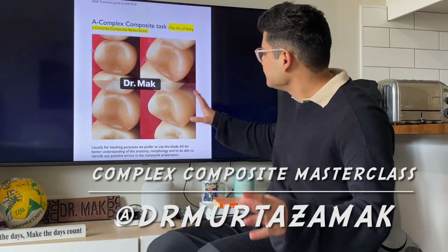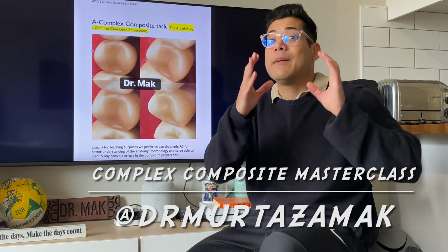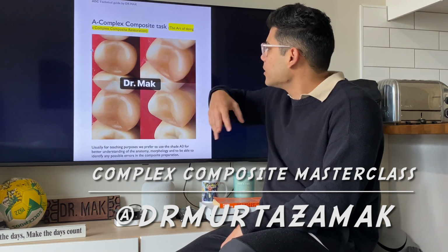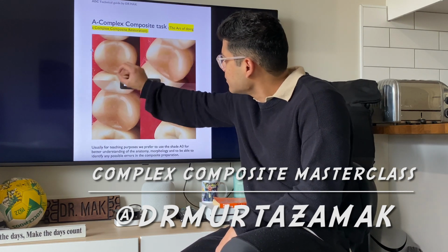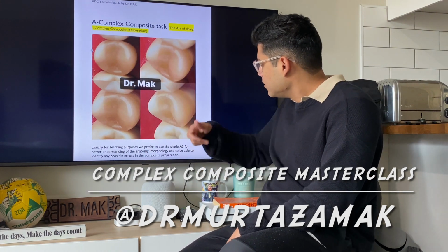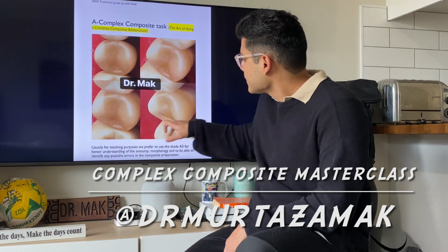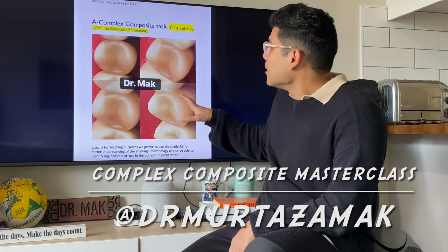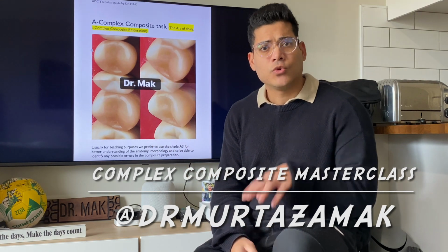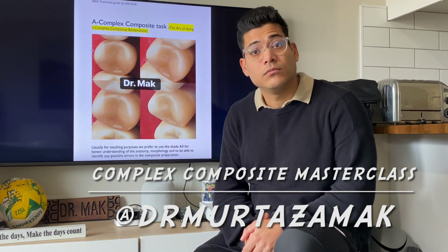Okay, so composite. Again, making sure it's ADC friendly, functional 6, remembering the fundamentals. If I see this composite, after knowing all the fundamentals, yes, it has a good contact. It has good thickness of margin and ridge. We don't see any excess or overhang. Tooth restoration junction looks nice and clean. Cusp positioning, cusp height. Yes, it looks fancy, but it fits in that fundamental rule as well. So whenever you do your composite, the first thing that runs in your mind is, yes, it looks fancy, but does it fit in the functional rule?